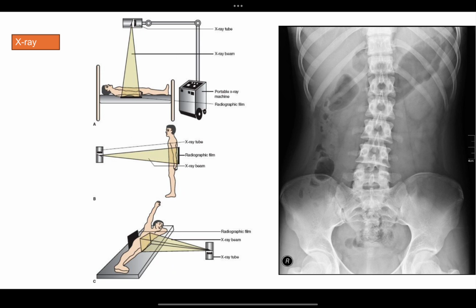radiography or X-ray. Radiography is one of the basic imaging methods used in gastrointestinal diagnostics. Abdominal radiographs are usually performed in the supine and upright positions and sometimes in the prone position. On plain radiographs without contrast enhancement, soft tissue structures such as the stomach and intestines are poorly visualized, while bony structures are clearly visible. For better visualization of the gastrointestinal tract, contrast agents are often used.